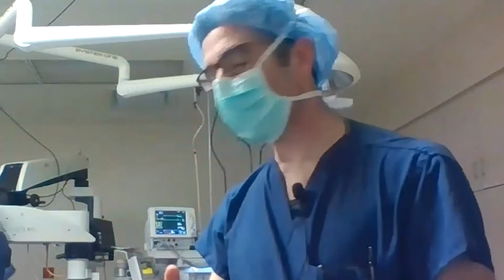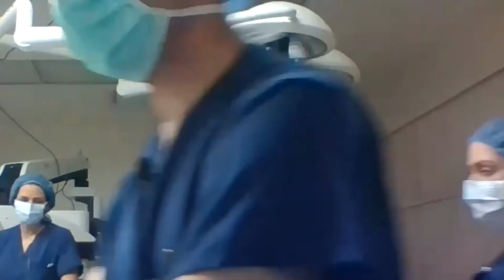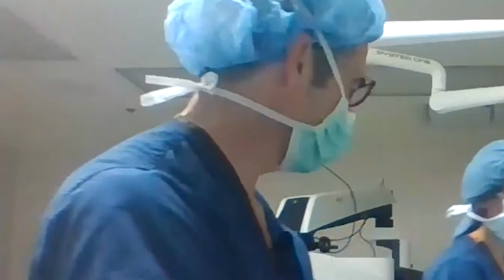Also nice to show you the eye wall infolding at the start of the case. I don't know if that was visible to you, but that was because the bed was high compared to the bottle. Normally I work with the bed lower, but I got distracted this morning a little bit with all the videoing. And the other thing that was interesting was the wound leak at the end there. You can see the bubbling going on. But if you're just patient and work with that a little bit, you can do pretty well and not have to get out the sutures and cut down the conjunctiva. So that's all well and good.